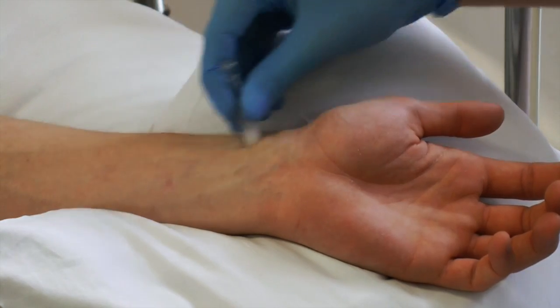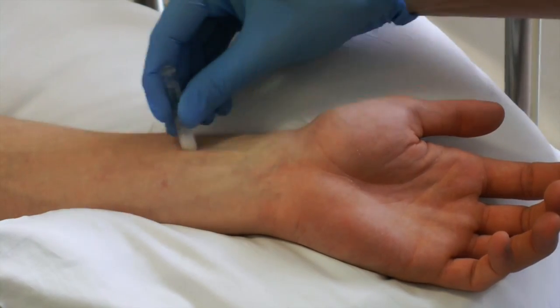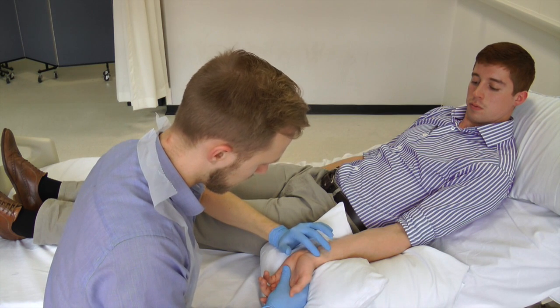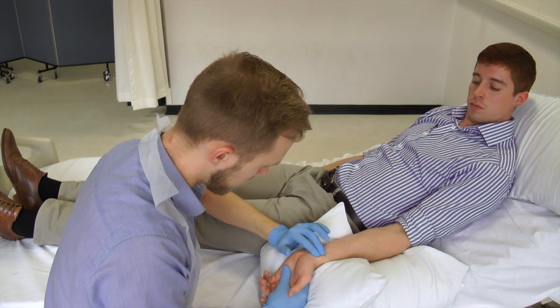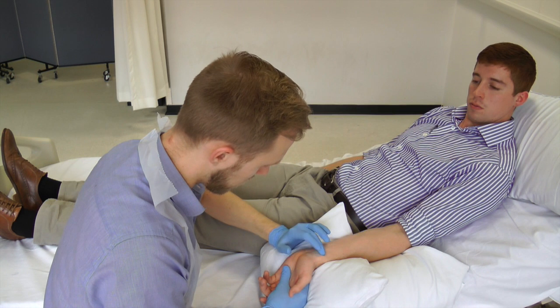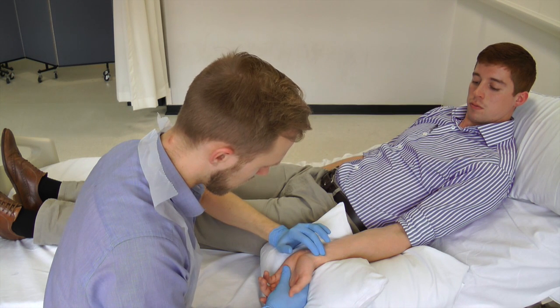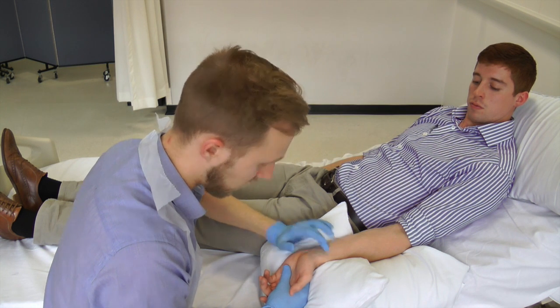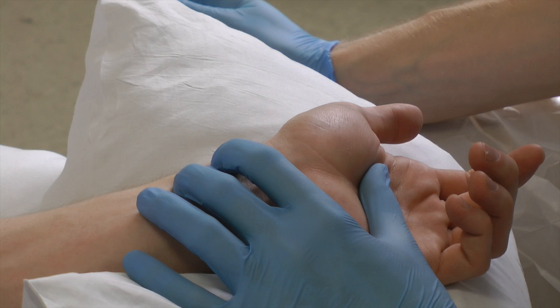Now thoroughly clean the skin. Locate the point where the artery is felt at its strongest. Extending the wrist gently brings the artery to the surface. Take your time to palpate the radial artery. Spending time here is worth it — by ensuring you have the optimal needle entry site, you can make this procedure a relatively painless one. Use your index and middle finger to locate the optimal position.